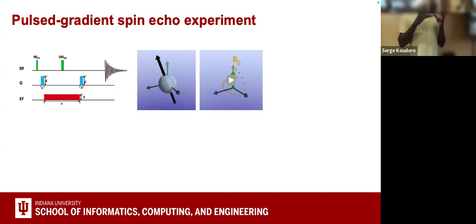So what they discovered is when you have a molecule, you apply a small push, I will call it a small push. So this is here your RF to this molecule. You wait, with a certain strength. Here is G, your gradient strength. So let's say you push your molecule, you wait a bit, and then you push back the molecule in the opposite way, and you wait a bit, and you try to see the difference.